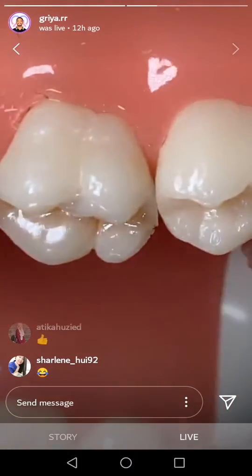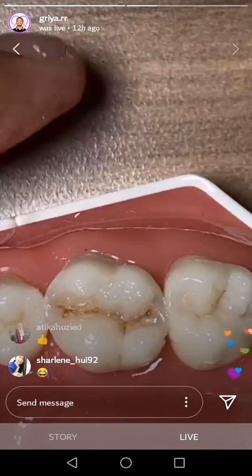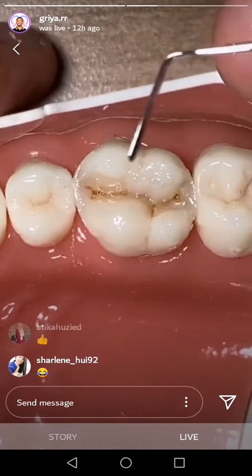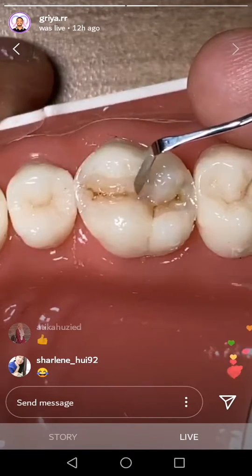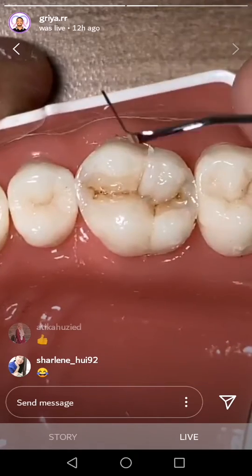See, I have a lot of excess in here. Oh my god. It's okay, it's okay. I love to do excess, yeah. And I love using this one. Yeah, this is a spatula, okay. So you need to do it like this, yeah.